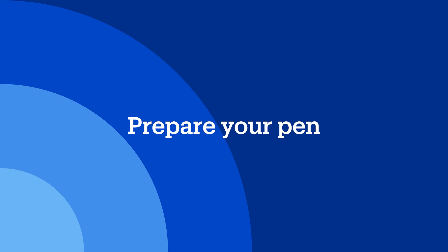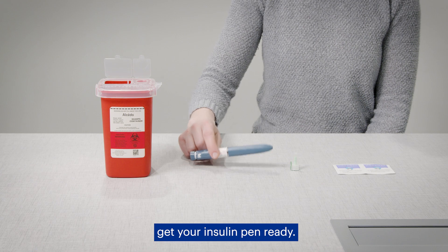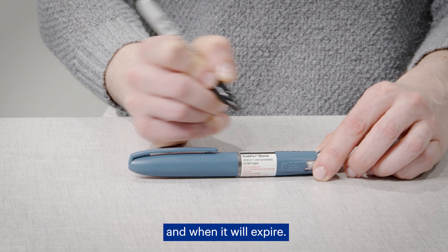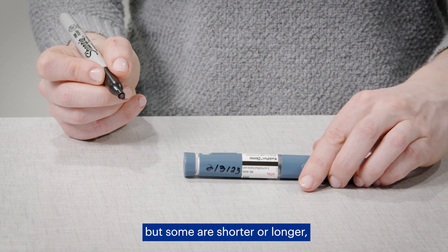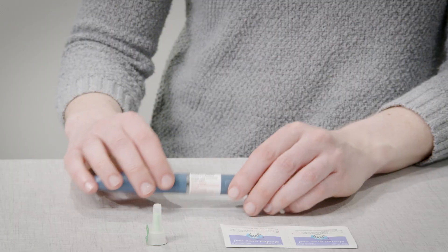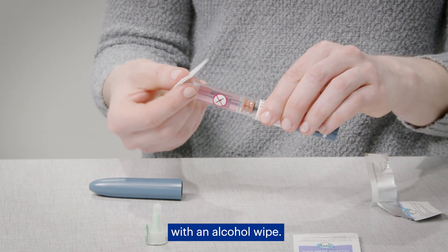Prepare your pen. Once you have your supplies, get your insulin pen ready. Write down the date you open the pen and when it will expire. Most pens are good for 28 days, but some last shorter or longer, so be sure to check the packaging. Next, clean the rubber seal on the insulin pen with an alcohol wipe.